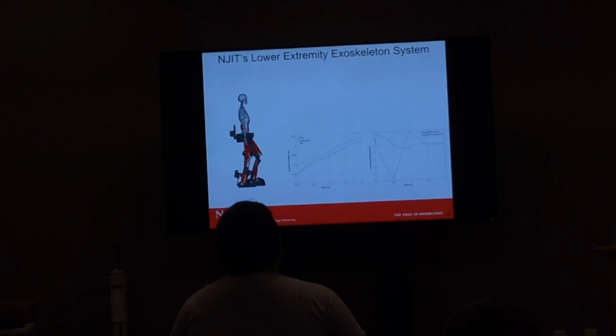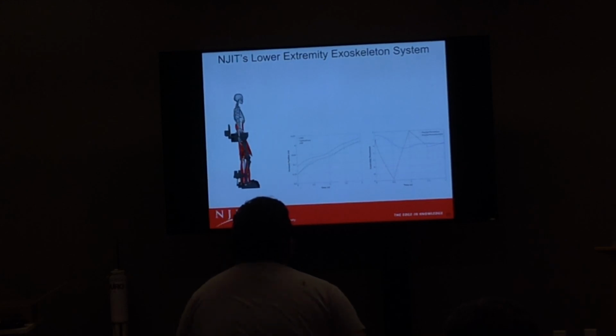Now we're currently working on running or walking, so it's not the most efficient walking yet, but that's the first step we are trying to do. We're looking at the balance, making sure it's stable. Human motion is not necessarily stable sometimes, okay? So this is a more conservative strategy. We're looking at zero moment point, capture point, center of mass, and all the dynamics.